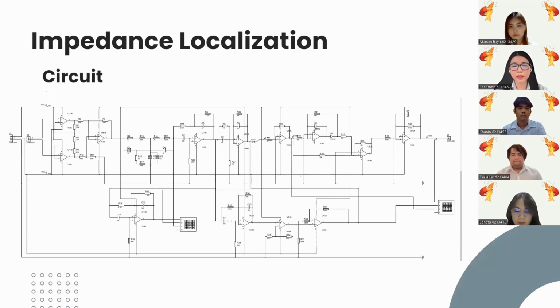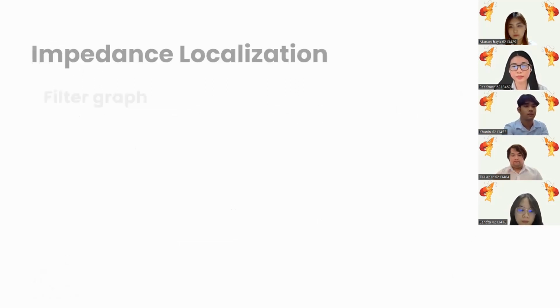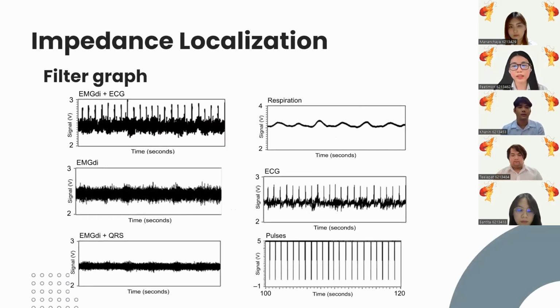Here is the schematic design of our filter circuit. The signal will pass through the filter bank according to its frequency axis. The filters are for, for example, ECG, EMG, EGM, and respiratory signals. These signals will be removed later. The signal will be sent through an ADC, the ADS131E04, and then sent to signal processing.